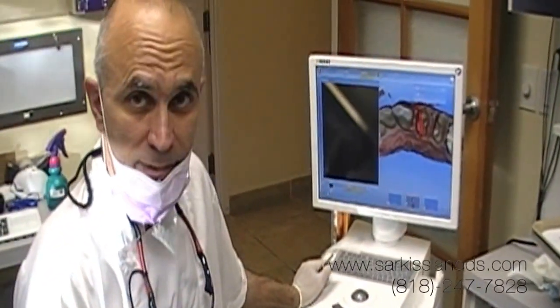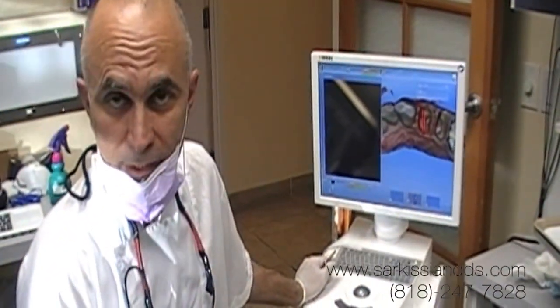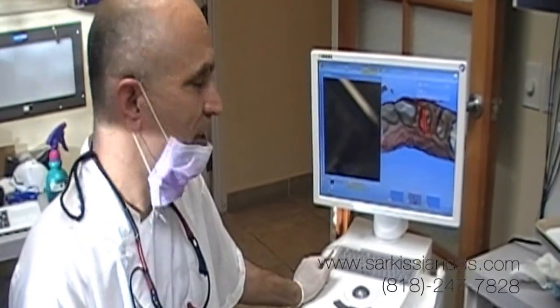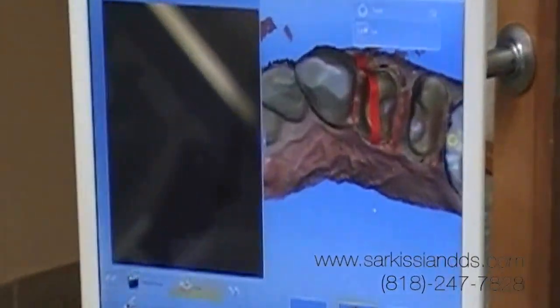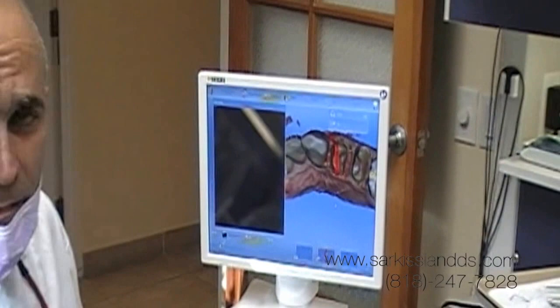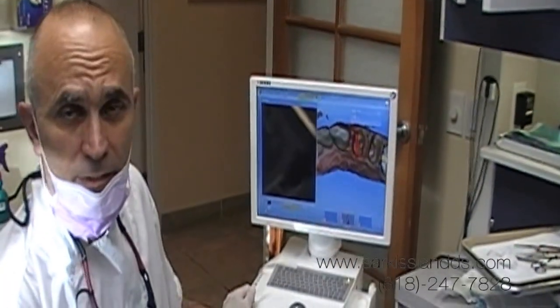Now we're just scanning the teeth after lasering the gums to expose the margins. We will be scanning with the CEREC digitally to be able to mill two teeth — 12 and 13 — with porcelain onlays.